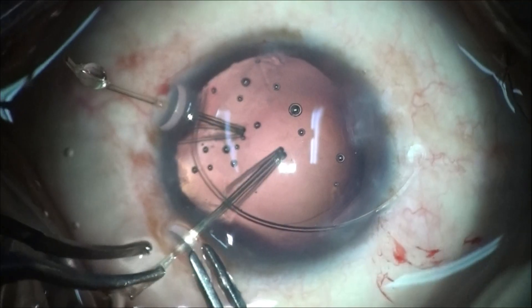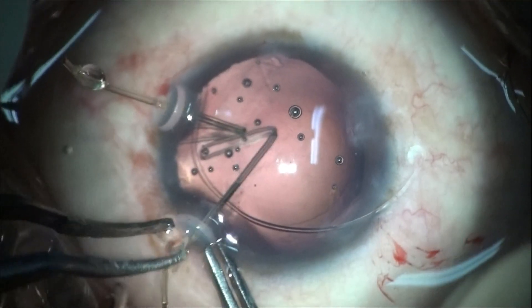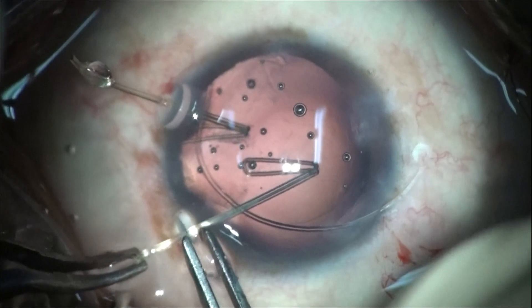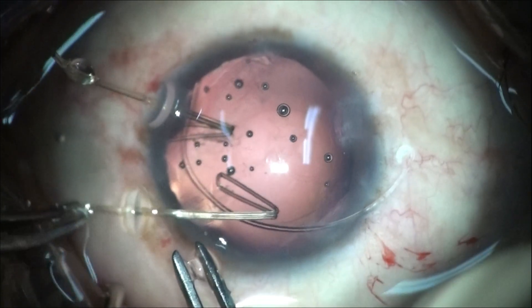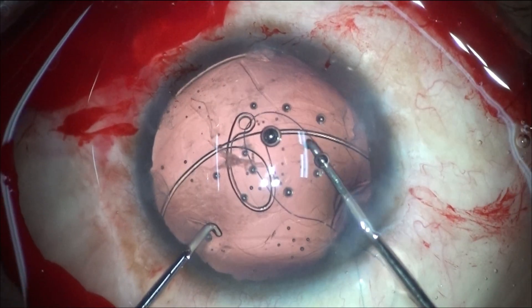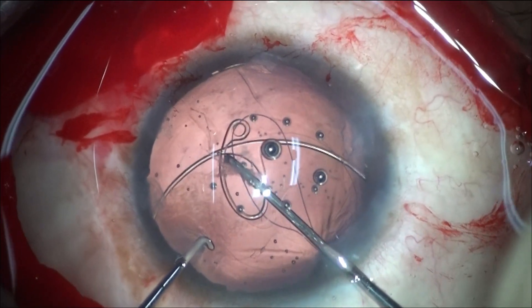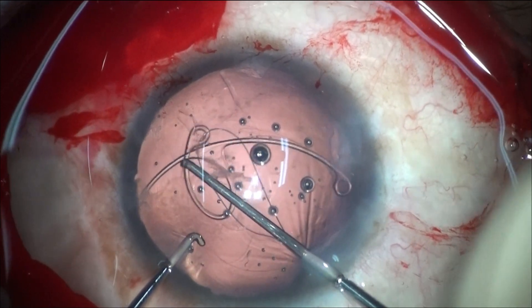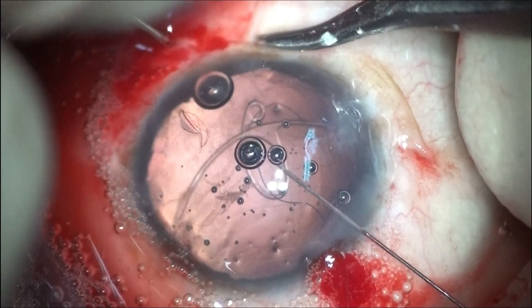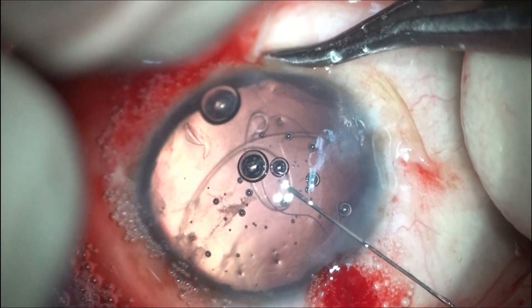This is a case of post-traumatic subluxation and in the inferior part you can see there is also traumatic mydriasis. There is atrophic iris there, and the plan is to first fix the bag and then do the pupil repair as well.